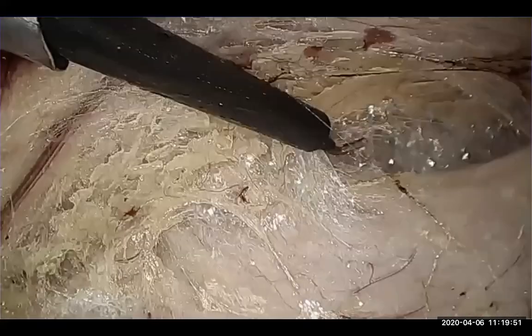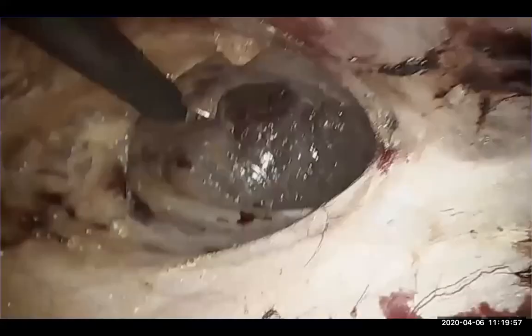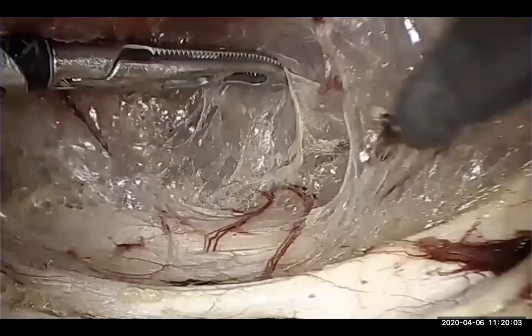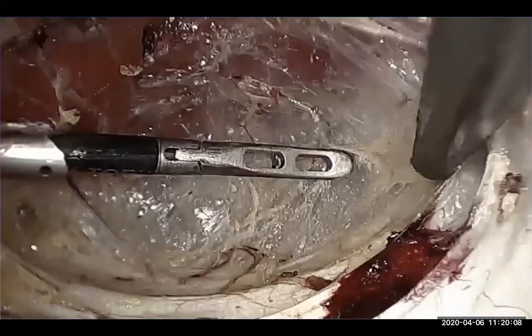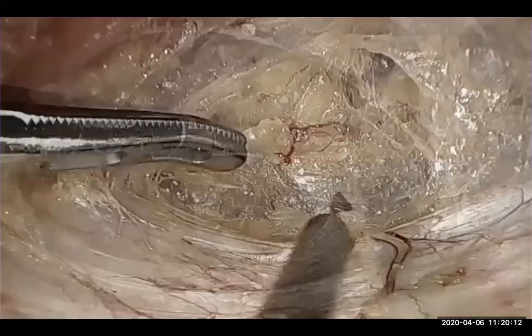It just makes it a little miserable to look at. And then create space for your second assistant port. Okay. So you can see that neurovascular bundle, and we are going in just medial to the linea semilunaris for the second assistant port, which typically, each port is around 5 fingers breadth or 4 fingers breadth from the previous port.